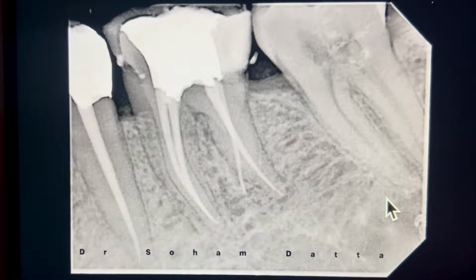This is another angulation of that case after the obturation. Mesiolingual, mesiobuccal, distolingual, and distobuccal.